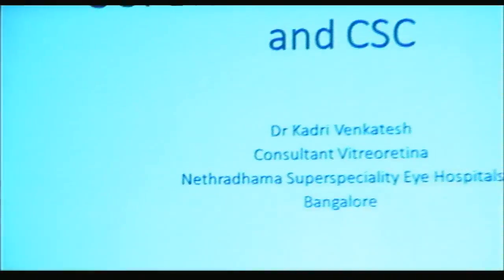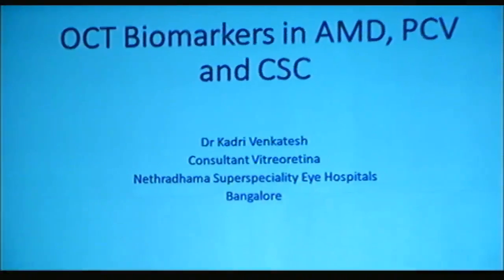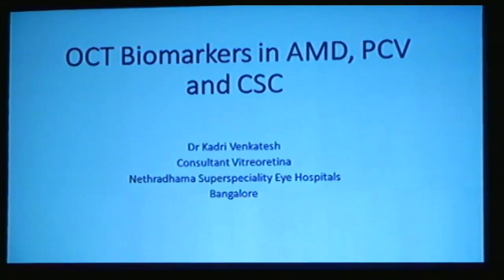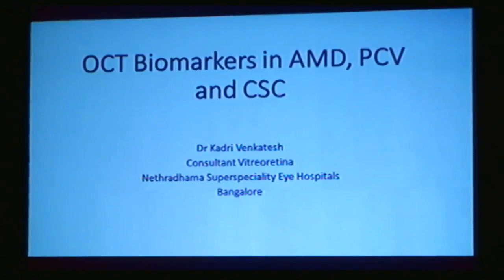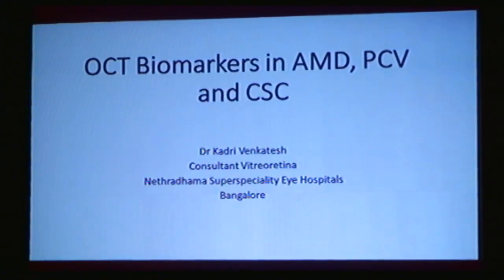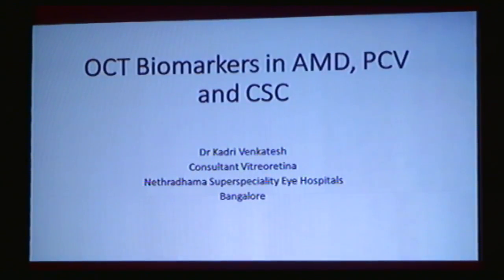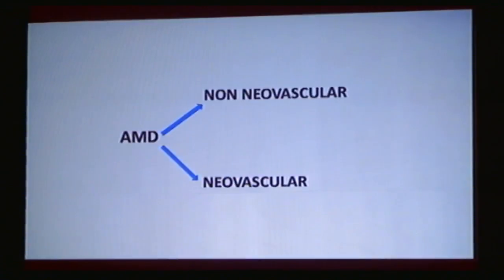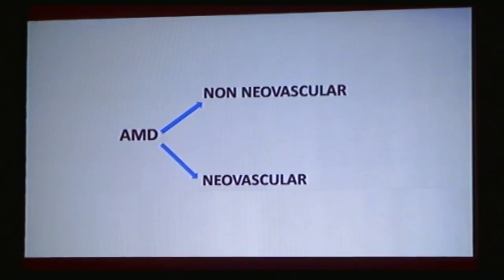So if there's one investigation without which the retina OPD never runs, it is OCT. Without OCT, I don't think we can run our practice as of today. So with that background, let's go through briefly these three very large conditions, try to do justice to each one of them. AMD broadly is classified into non-neovascular as well as neovascular.